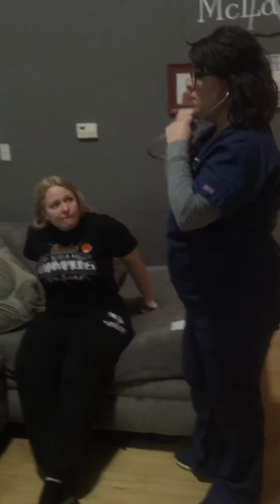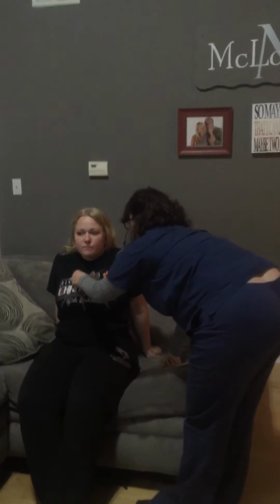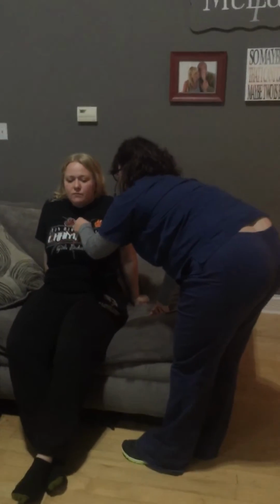Okay, good. So here we can also listen for cardiovascular sounds with our diaphragm and bell. We want to make sure that there's no murmurs, no mammary souffle, so aortic, pulmonic, Erb's point, tricuspid, and mitral.